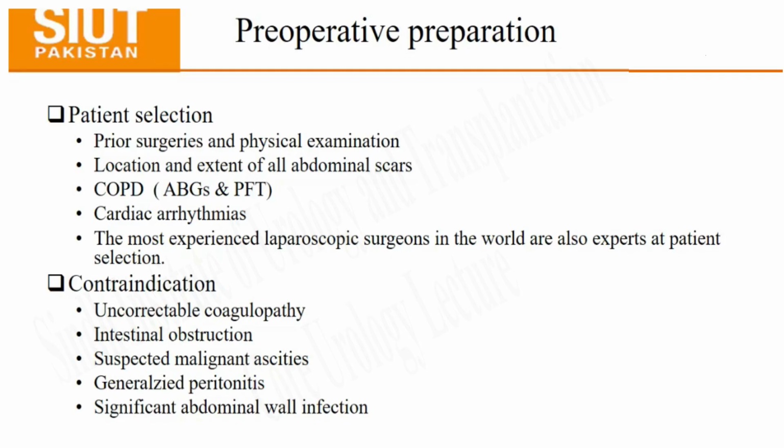Sir, for example, when we do surgery we are used to feeling the tissue, so how has the robot replaced the tactile sensation that we use? Sir, we have technicians who help the surgeon to identify, or who have the tactile sensation, or who have laparoscopic instrument. But in partial nephrectomy, visually seeing the tumor and the extent of the tumor is better displayed than with the naked eye, because of 3D vision. We identify the tumor extent, and if we are in doubt that some tumor remains, we use laparoscopic ultrasound so we can identify the remaining tumor.